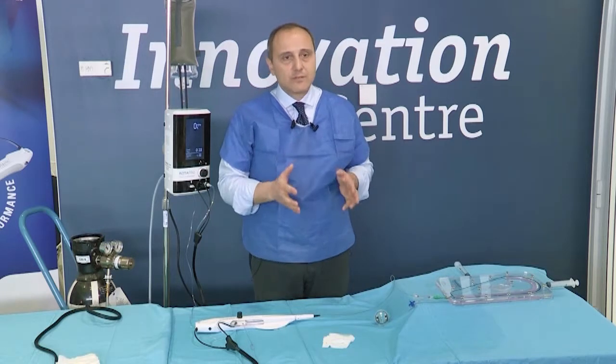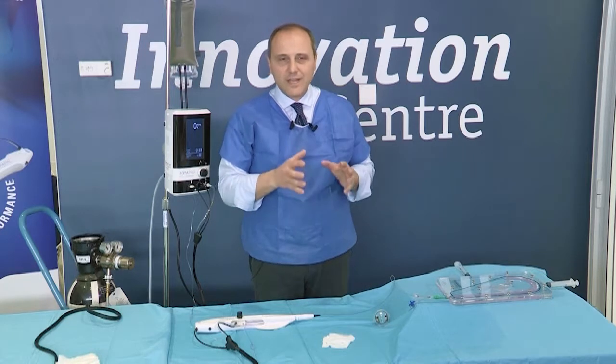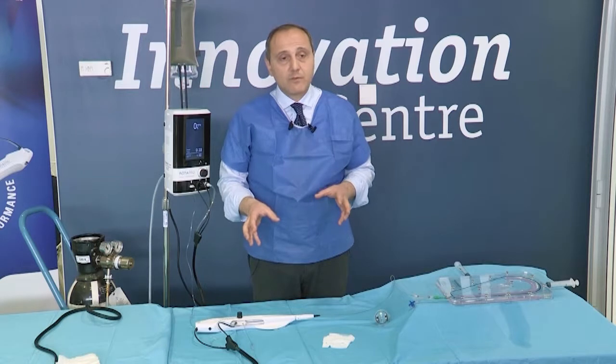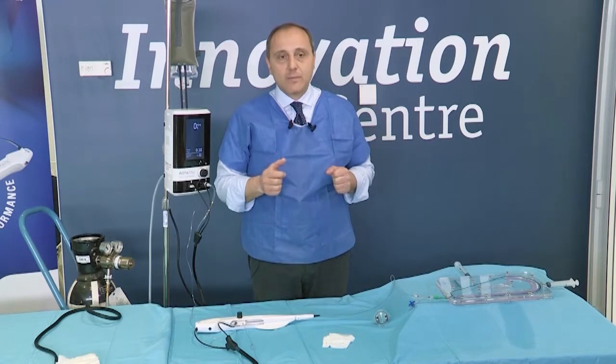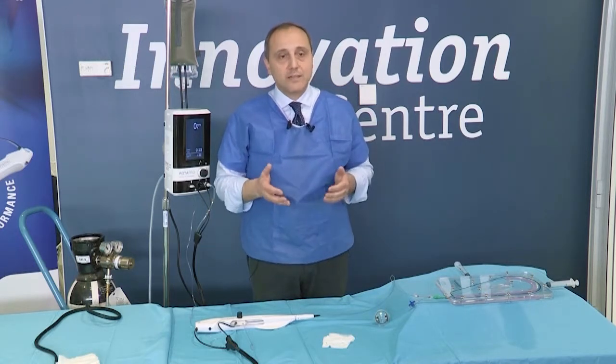As you have seen, everything within the patient has just remained the same, so the rotablation procedure has not changed at all. All the recommendations of the consensus document, the good suggestions coming from the expert colleagues of the Euro 4C Club have just remained the same. What has changed is in the advancer, as we said before, and in the console. With this, I invite you to watch other videos and webinars that have been prepared for you on PCR Online, where you could see this new system being used during a real-life case.